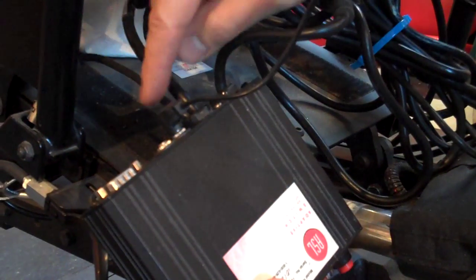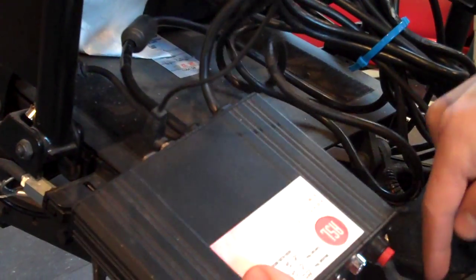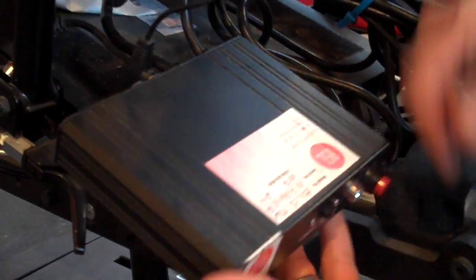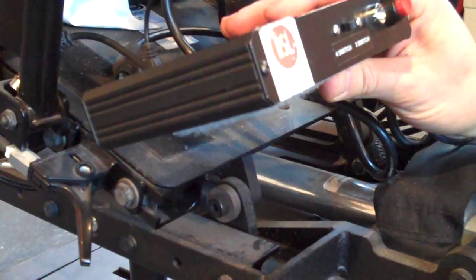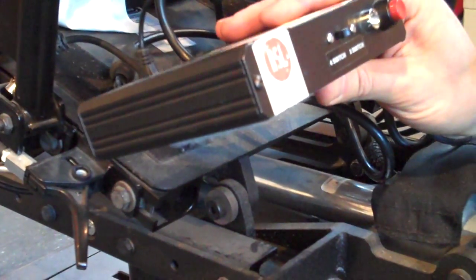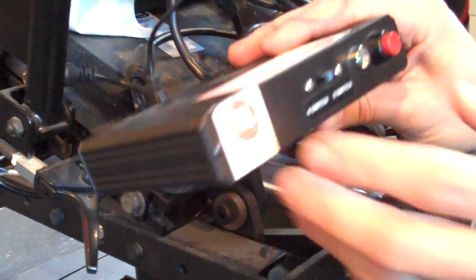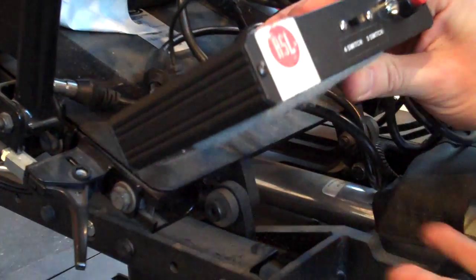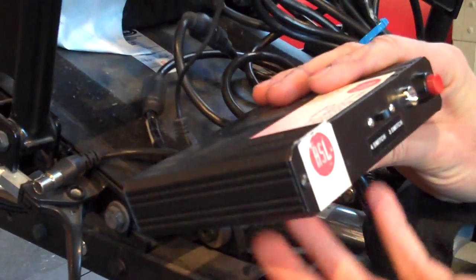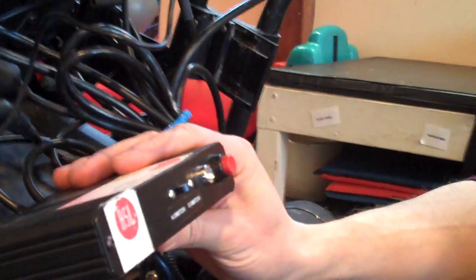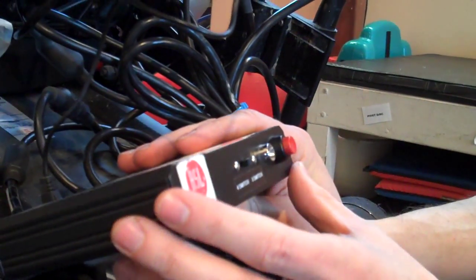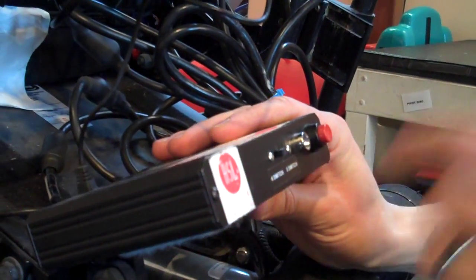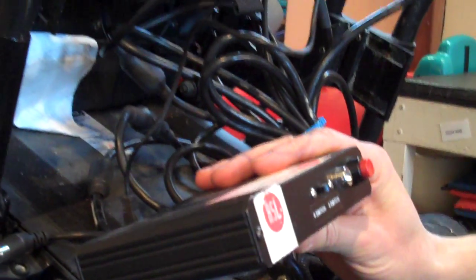This makes a usable signal that the wheelchair will understand. The signal goes out from here and into the power chair drive system. This makes the controls from the head array usable for the power chair. This has to come from ASL, and you have to specify what kind of power chair you have so that this box is specifically designed to work with the electronics in that power chair.